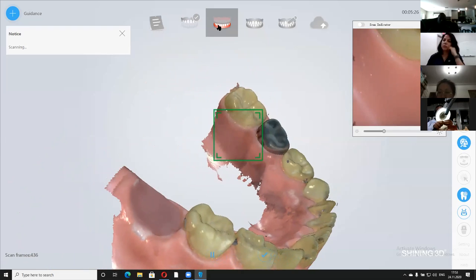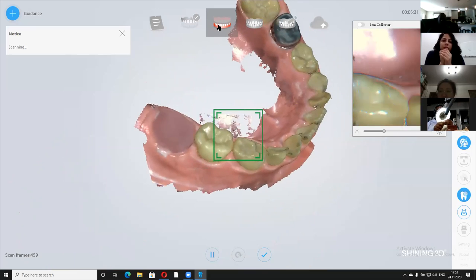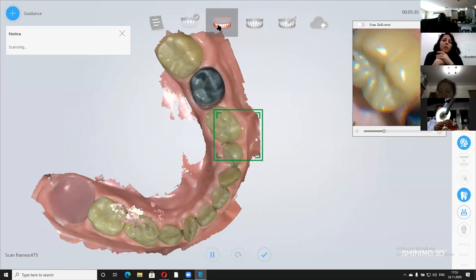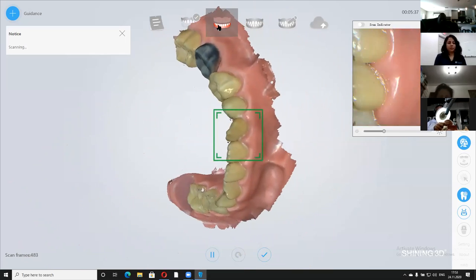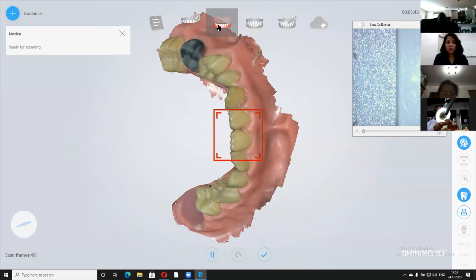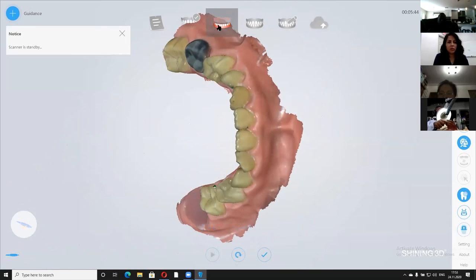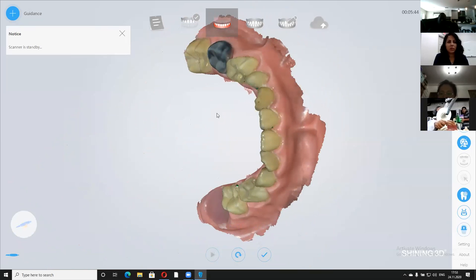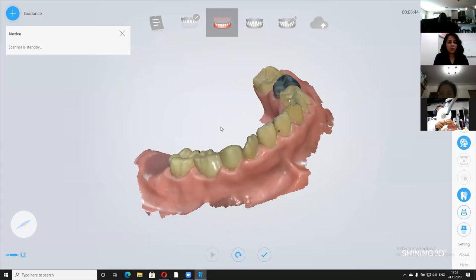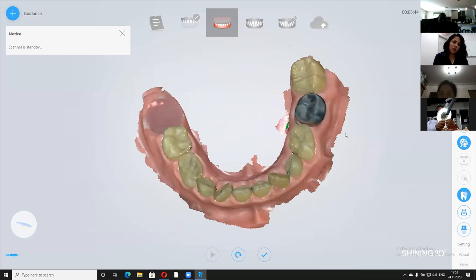So I've scanned this, I jump to this side. It instantly finds it. You see my fingers on there? And now it just cleans it away. This is what I really like about this data optimization, okay? So the scan has happened. I put my thing down. It cleans everything now. So the scan has been cleaned. There's no real debris hanging up here or those kind of things. Let's say we are happy, maybe there's still two, three small holes like you see here, but I'm not going to bother. It's the opposing side.